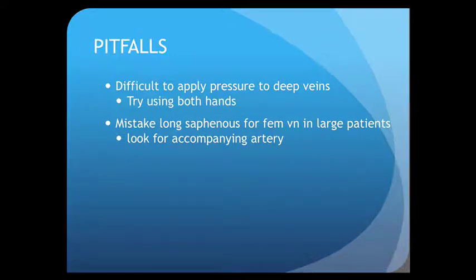If you're having trouble putting enough pressure on to compress the vein, for example in a very large leg, don't be afraid to use two hands and with your other hand reach behind and push up from below.